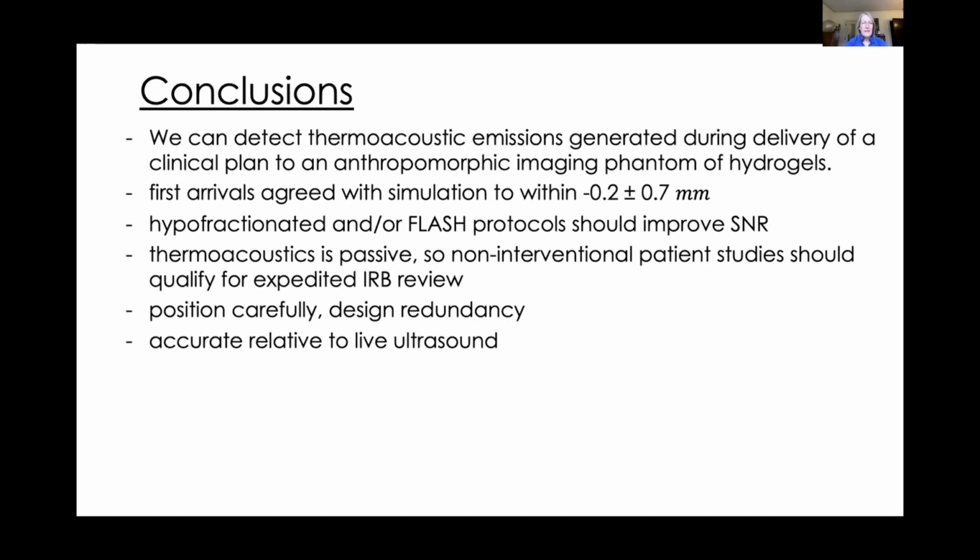And one of the things that is really a big push these days is to hypofractionate treatments, to put patients on the table less frequently and deliver higher dose each time. So, many protocols now require patients to be treated over the course of many weeks, several dozen times. And part of the reason they do that is simply because they know that positioning errors will cancel out if you put the patient on the table 30 times. So a protocol that only requires positioning the patient 5 times really means that you've got to be absolutely certain you've treated correctly.